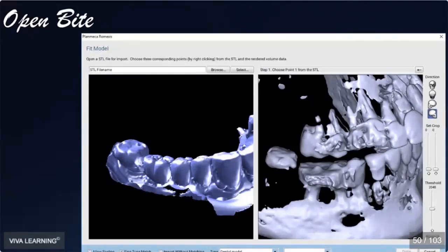roll. And what this means, if you look at the image on the right panel, is that teeth with a large restorative history can be really difficult to merge together with your intraoral scans. If you can see on those molar teeth that have been restored with crowns, they throw off a lot of artifact. Even if you play with the threshold settings to eliminate that, it's almost impossible to get that to go away. So sometimes the only landmark you can use to verify the matching of all that together are those little cusp tips. And I think you can see those on the scan. So really important to have an open bite.